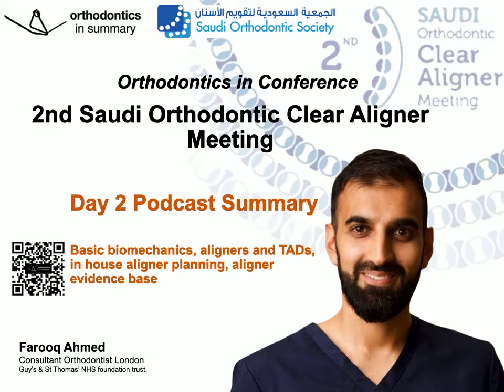He mentioned this is difficult to achieve with aligners, but his solution was simple, and again it comes back to staging tooth movements. If we distalize the tooth to begin with, we accept it's going to rotate to a degree, and then once it's distalized into the space, we then put the counter moment or counter rotation in to correct things.